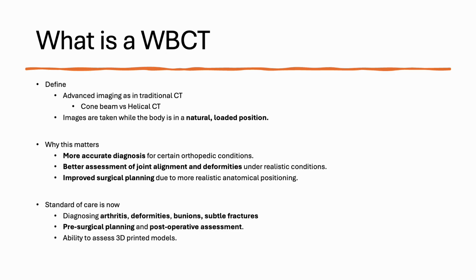Standard care is now that we can diagnose arthritis a little bit better. We can diagnose deformities a little bit better. We can diagnose bunions a little bit better. We can diagnose those subtle fractures or syndesmotic injuries, rotational injuries at the distal fibula, Lisfranc type injuries.